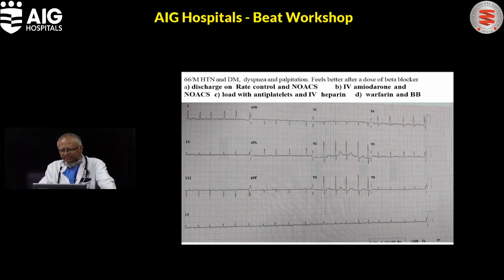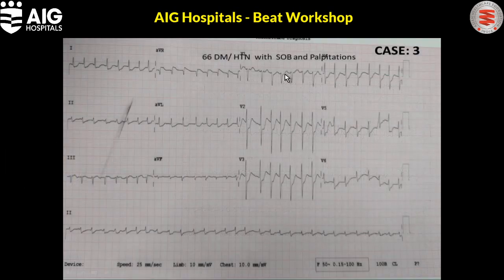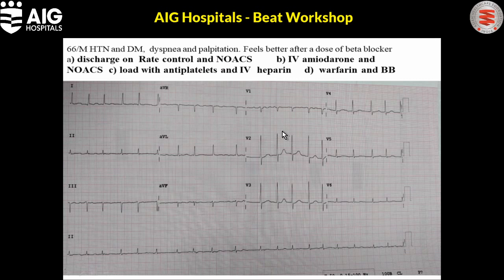Now this is a very interesting ECG. We have shown this before. When you see a disparity in the ST segment between V1 and V2, V1 showing a T wave that is upright, with a significant ST depression in V2 and a tall R, a sudden increase in R wave voltage in V2, you should suspect a dorsal wall infarction, posterior wall infarction.